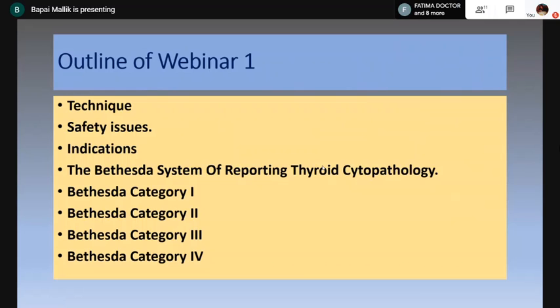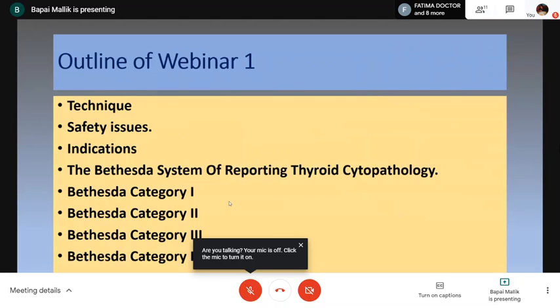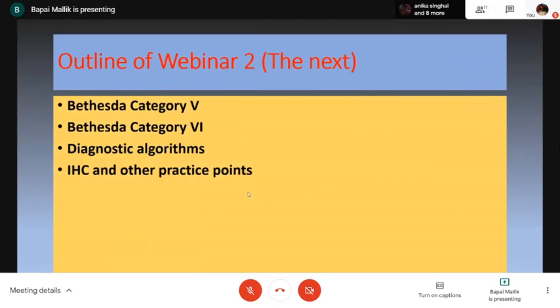So as far as this webinar is concerned, this is going to be the general outline. I shall be dealing with Bethesda's 1 to 4. But before that, I'll be dealing with a few other issues. And in the next webinar, which is going to be coming up sometime soon, I hope, you are going to be notified about that webinar. In that I shall be dealing with Bethesda's categories 5, 6, some diagnostic algorithms, the role of immunohistochemistry, some other ancillary tests, and other practice points.